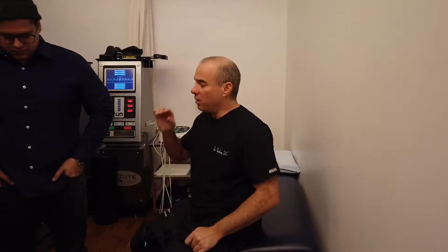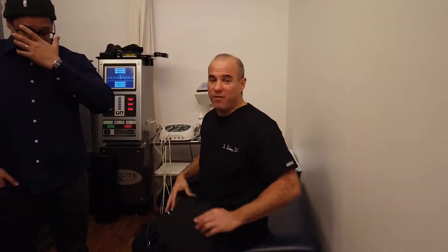We're putting a patient on the decompression machine — the DRX-9000 spinal decompression machine — for a patient that has a lumbar herniated disc, specifically an L5 herniated disc that is pretty partial to the S1 nerve root. We actually have a patent on this decompression system; we incorporate spinal decompression with cold laser therapy and chiropractic care — that's how we get our results.